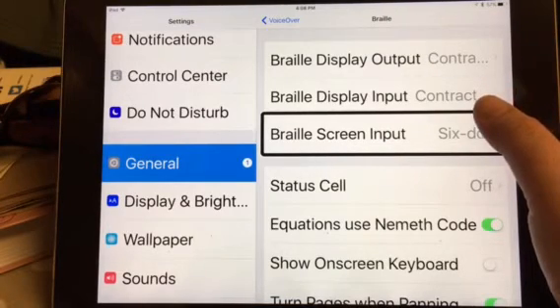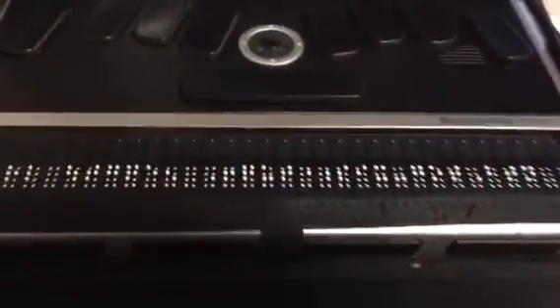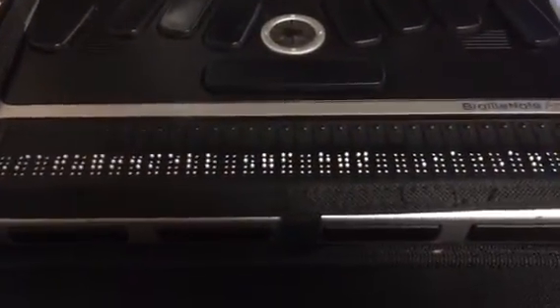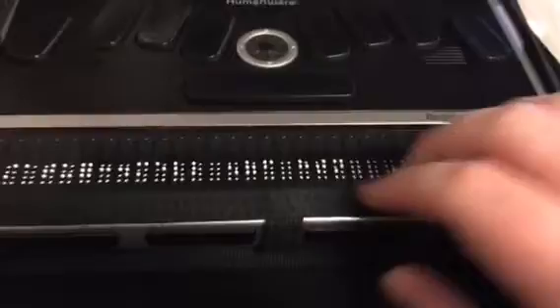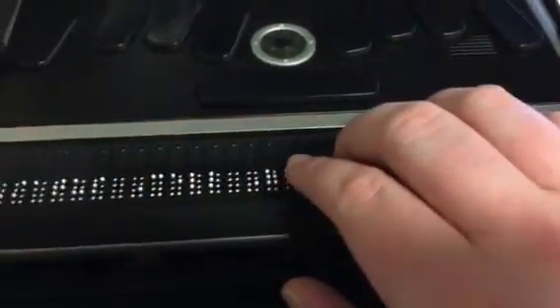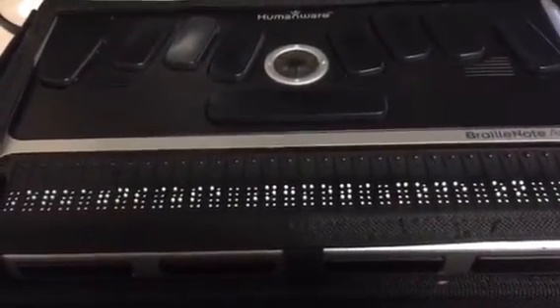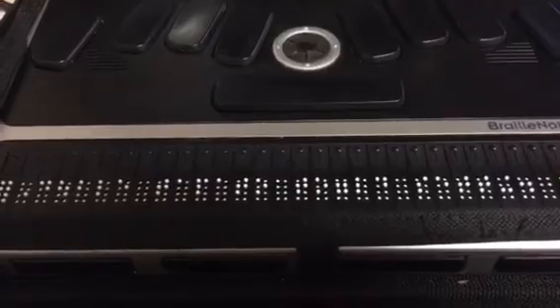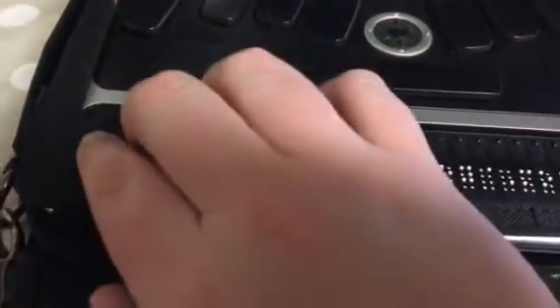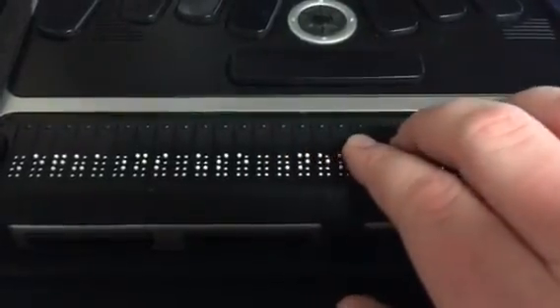If you guys have any other questions, just let me know. Now that it is paired, I'll show you what it does. If I swipe on the screen, everything that pops up on the Braille display is what it says on my iPad. It says 'equations using Nemeth code.' So now on the Braille display, it says 'equations using Nemeth code.'